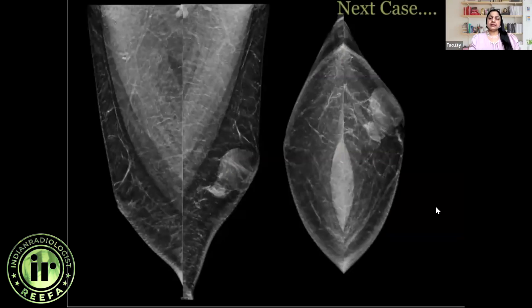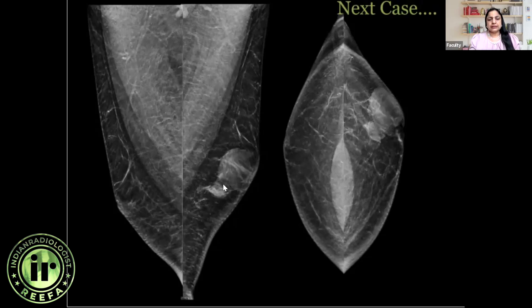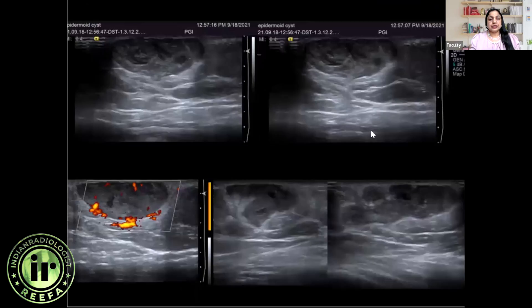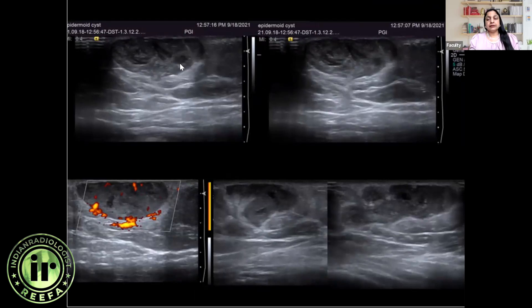Sometimes pre-existing cystic lesions such as benign cysts, fibrocystic disease, sebaceous cysts, or epidermoid cysts may also get infected. This was a 24-year-old male who underwent diagnostic FNAC after presenting with a palpable breast mass. Mammogram showed a well-circumscribed oval equal-density mass close to the skin in a periareolar location, with an undulation from its inferomedial aspect likely due to post-FNAC change. Ultrasound revealed an oval circumscribed parallel mass just under the skin with characteristic hyper- and hypoechoic rings giving a classical lamellated appearance, diagnostic of a breast epidermoid cyst.